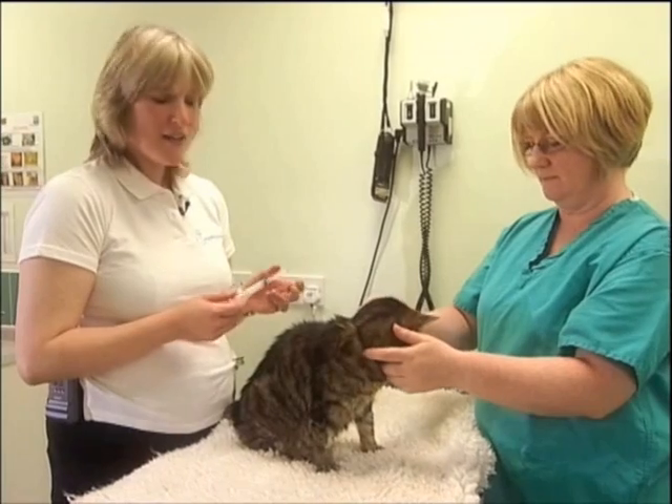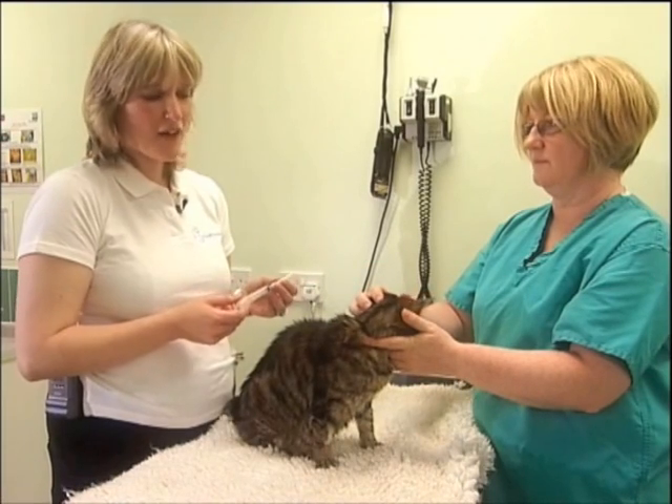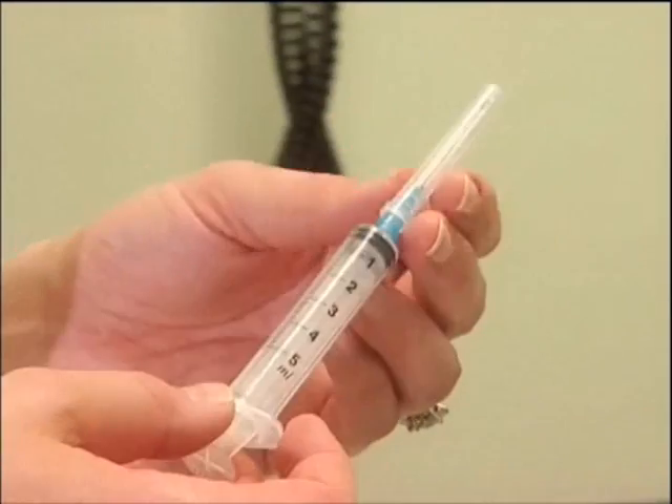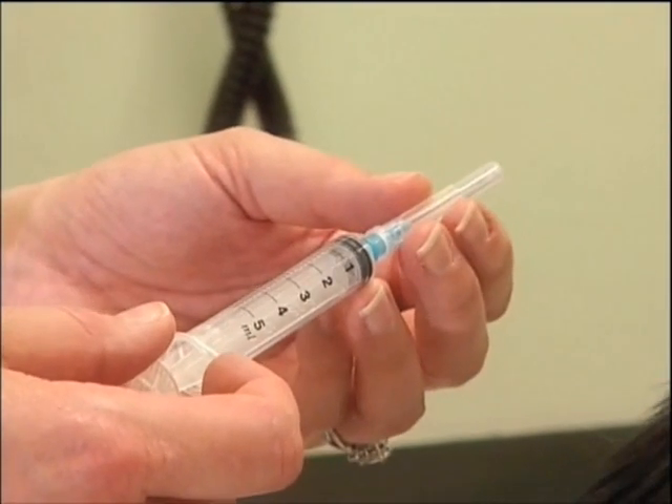Cystocentesis can be done with the cat in any position — standing, in lateral recumbency, or lying on their back. The main thing is that they are as relaxed as possible and you can still palpate the bladder whilst doing this procedure. The equipment I use to collect a cystocentesis sample is a 5 or 10 ml syringe and a 23 gauge needle, usually a 1 inch long needle.